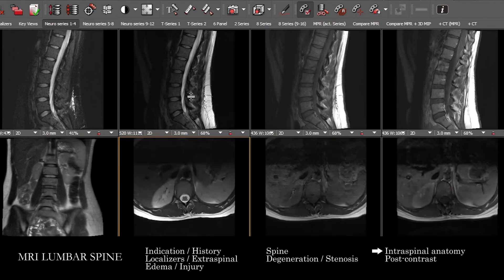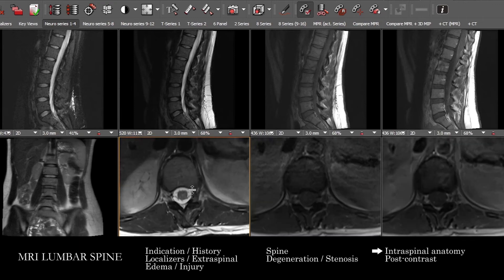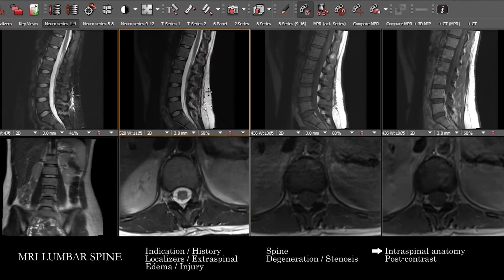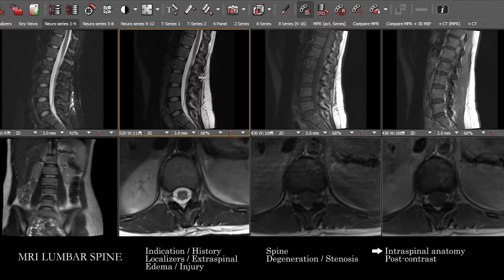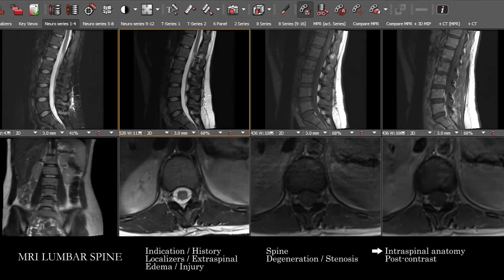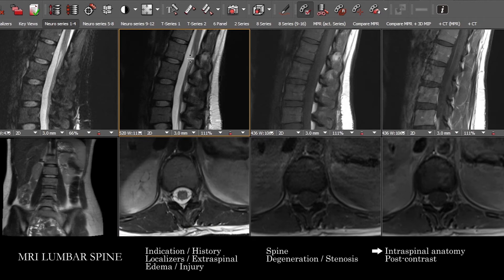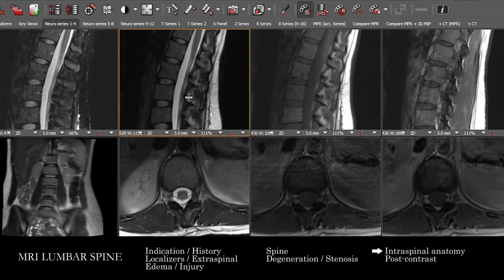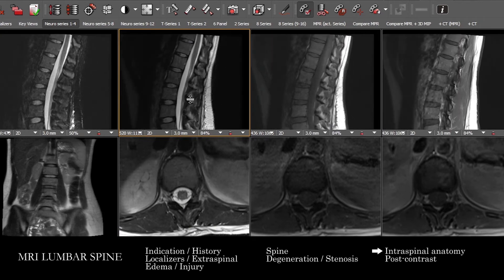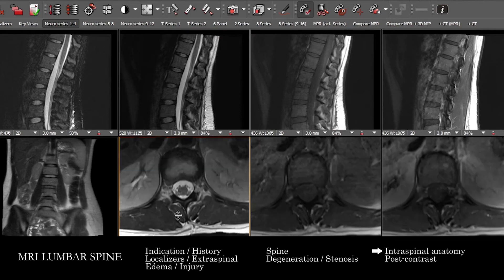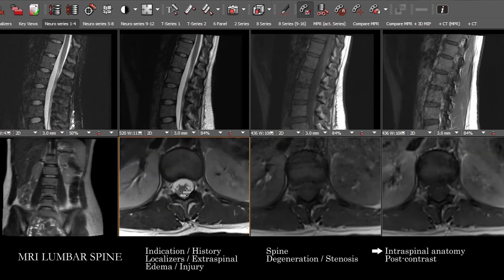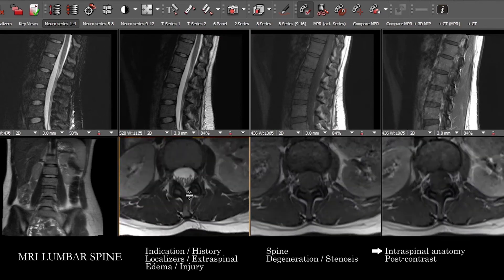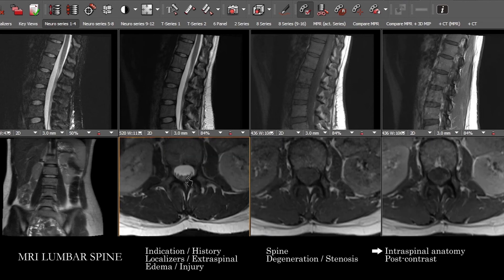It should be noted that frequently the sagittal images are going to have a lot of artifacts in the intraspinal compartment, and frequently you can best rely on the axial images to give you a true sense of cord signal abnormality.